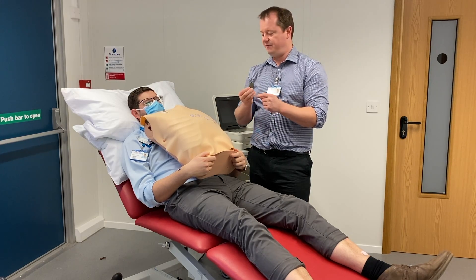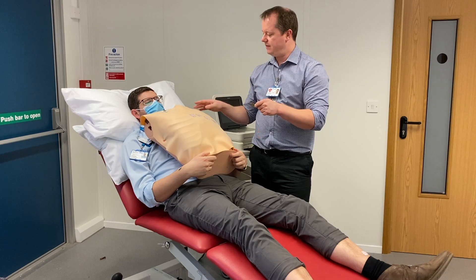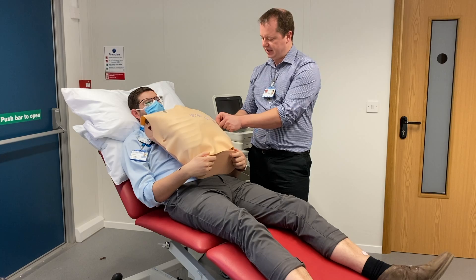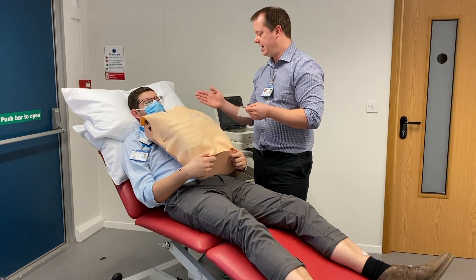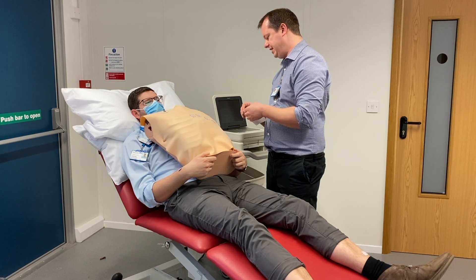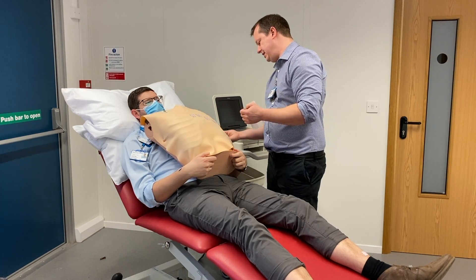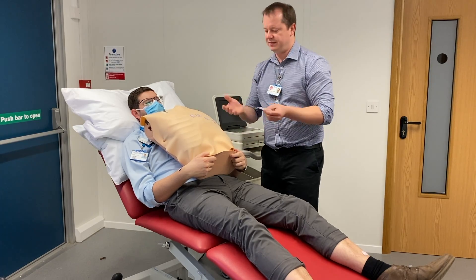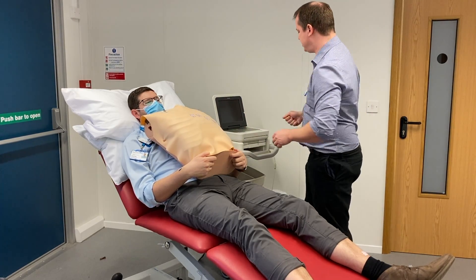Now we can stick V3 on, because V3 lines up to the ones either side - it sits exactly halfway in a diagonal line between V2 and V4. After that we can put V5, which is at the anterior axillary line and is directly in line with V4. Then V6 which is mid-axilla and is exactly in line with V5. Once we've got all our tabs on, we're ready to attach the ECG machine.